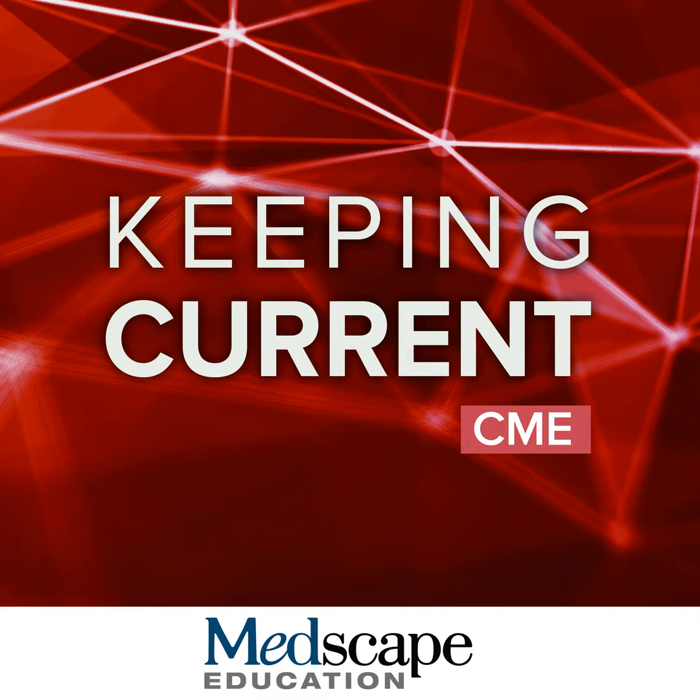And so far, there have been 3 of these AMRIs, or abbreviated MRI protocols, studied. One's the hepatobiliary phase AMRI that is using gadoxetate. Then there's dynamic contrast enhanced AMRI, which is using an extracellular contrast agent. And finally, a non-contrast AMRI. I'm going to focus on the gadoxetic acid enhanced hepatobiliary phase AMRI.